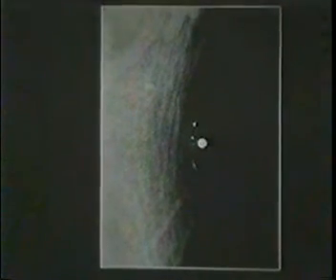The breast is then rotated slightly and the C-arm primarily rotated until this BB is tangential to the X-ray beam. And with the collimator light on, we usually are able to see a cast of the BB on the bucky below. And we can see it right here, and that proves that it's a tangential view. With that maneuver, we can determine whether or not the calcifications are in the skin.